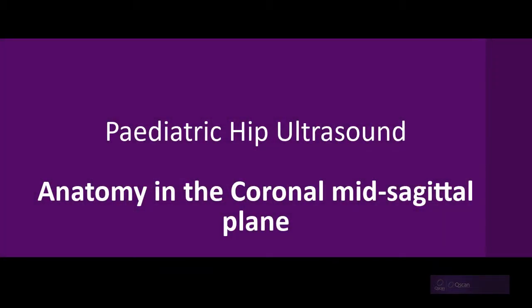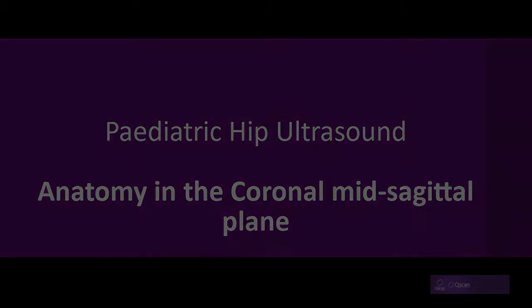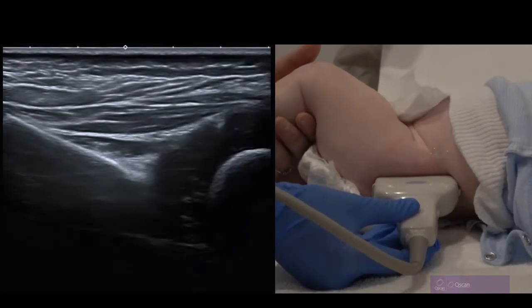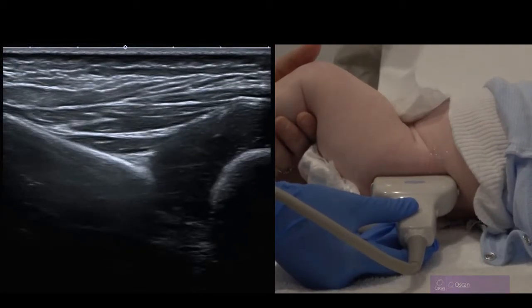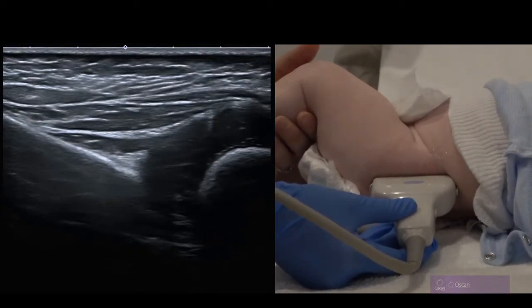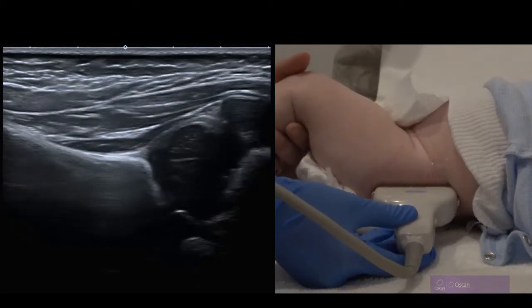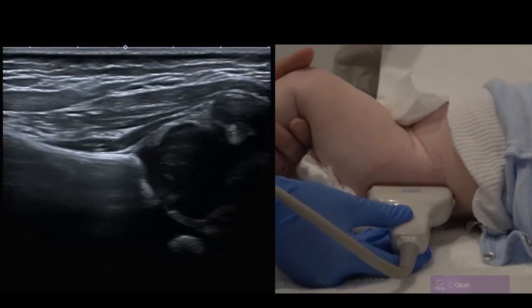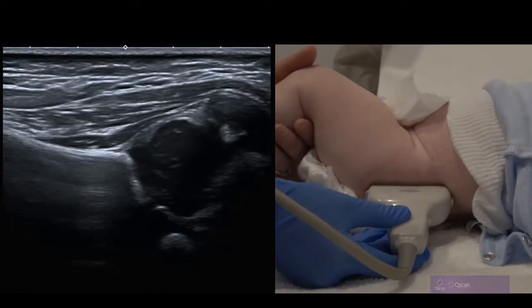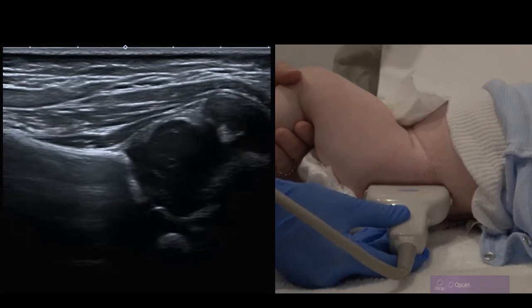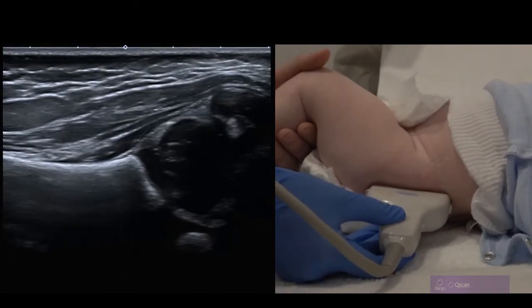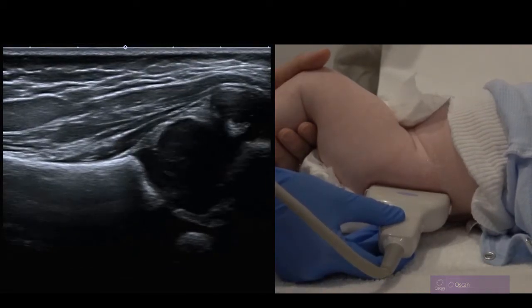This is the anatomy of the pediatric hip in a coronal mid-sagittal plane. We can see the transducer is initially quite anterior and not mid-sagittal. The ilium is sloped but then progressively becomes horizontal and parallel with the transducer as the probe is in the mid-sagittal plane.